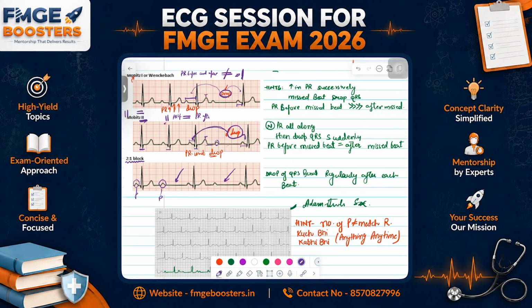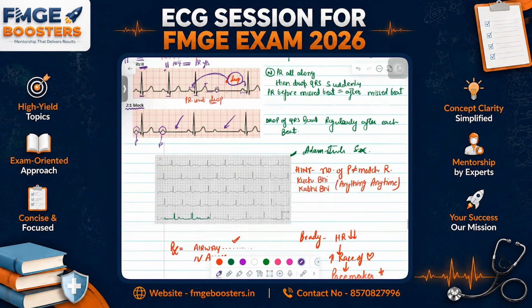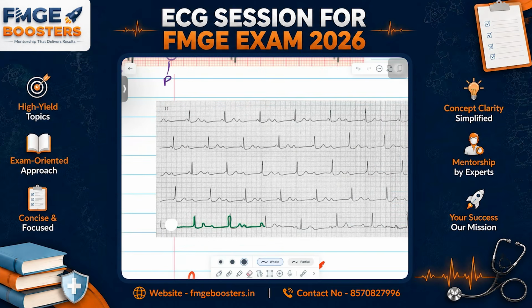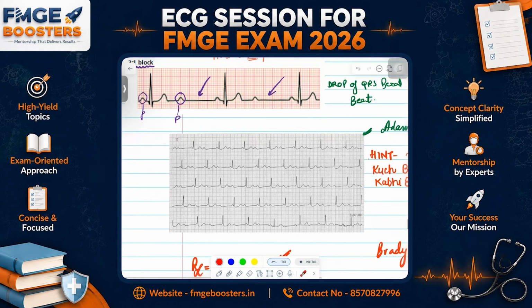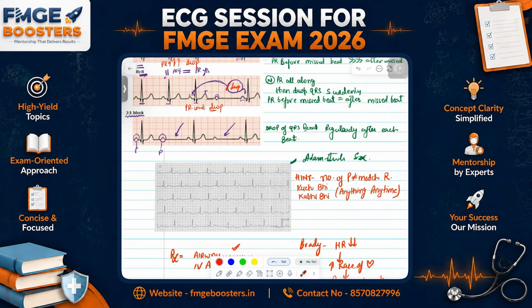If you remember even by the image of the ECG, you will be able to remember it in the exam. Okay? Done. Now tell me about this one. This ECG: T P Q R S T P Q R S T. Anything is happening anywhere. It is non-synchronous. A very strange ECG is running. Is it type 2 or type 3? Number of P does not match number of R. It is type 3. It is also known as Adams-Stokes syndrome. Okay? Clear everyone?